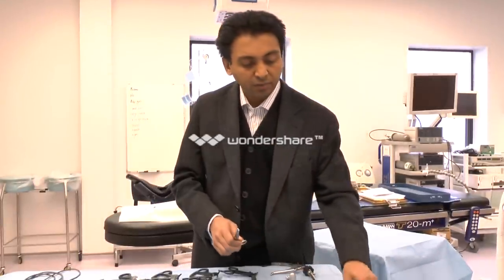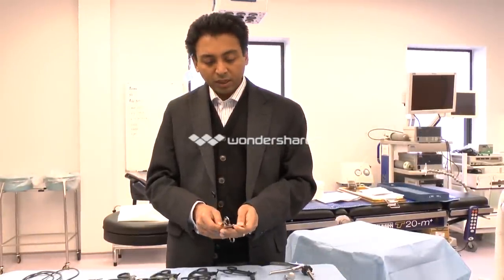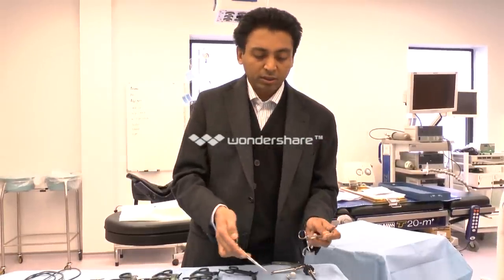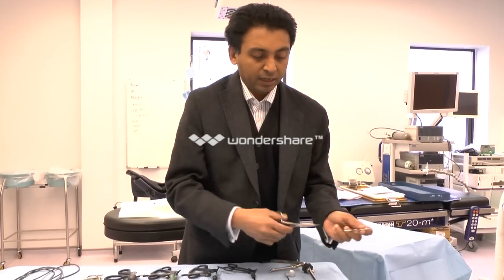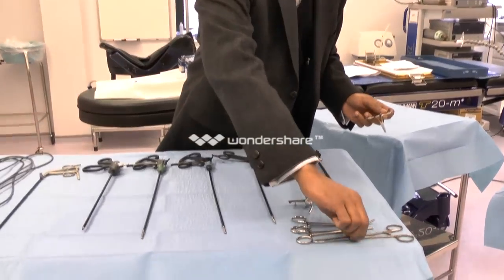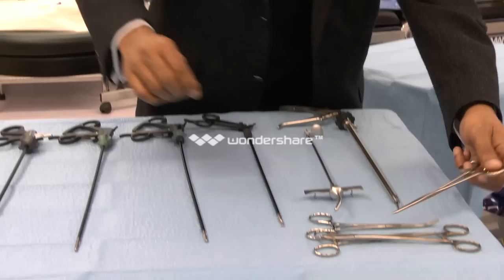Though there are randomized controlled trials which dispute that, it does make identification of bowel injury easier. You use these Kocher's forceps and dissecting forceps like this, and sometimes a little elevator to help you elevate the umbilicus as you do this cut down.